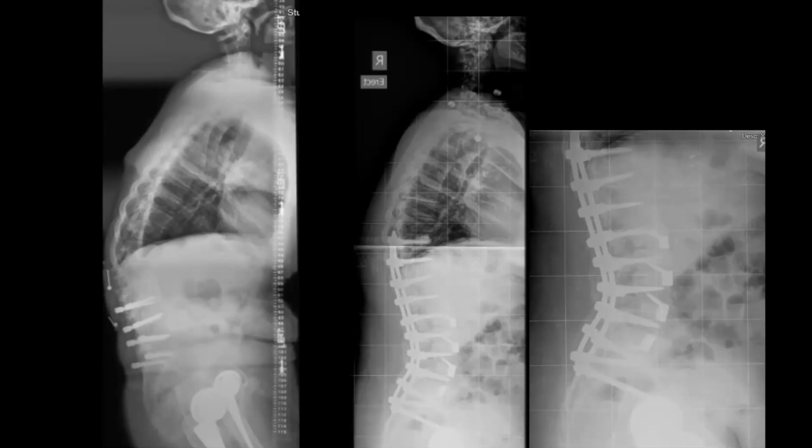Yep. And really, as you suggested, avoiding getting too much foraminal stenosis. So many times there's the temptation to put in a hyperlordotic 24-degree ALIF cage that might only be 4 millimeters high in the back. And I really worry about inducing foraminal stenosis there.